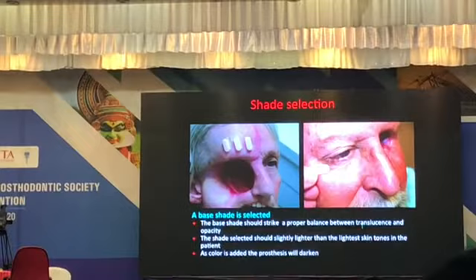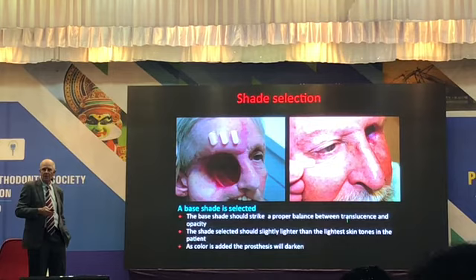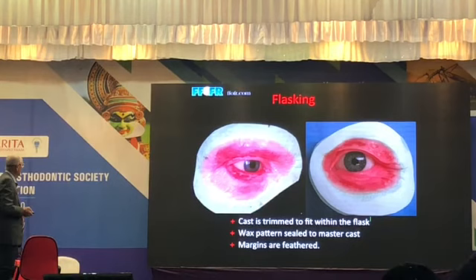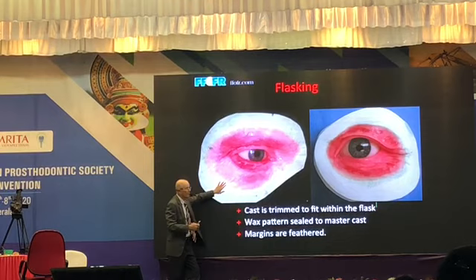And then we have a series of shades. I have some up here, and we pick a shade that's the lightest skin color in the adjacent area. You always want to err on the light side, because as you add pigmentation, the whole prosthesis will darken. You pick a shade slightly lighter than what you see, and then you trim the cast and adapt the wax pattern to the cast, and you feather the margins. Make it as thin as possible out here as it blends into the natural skin.